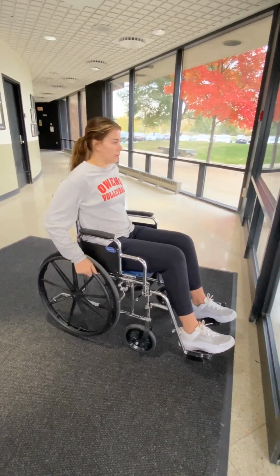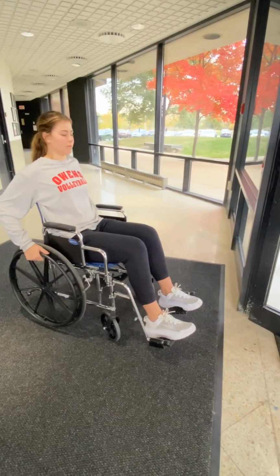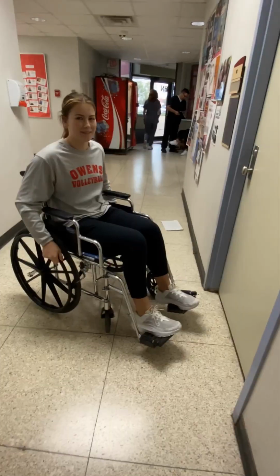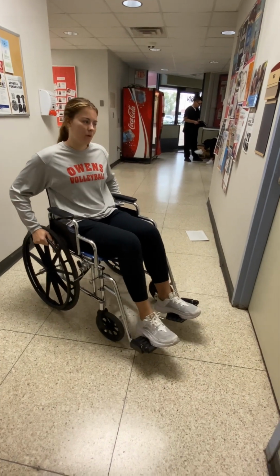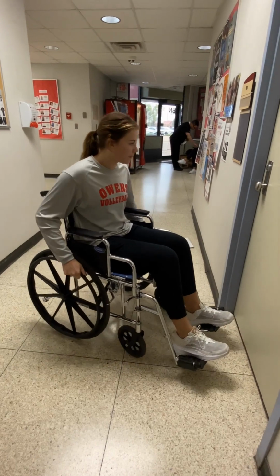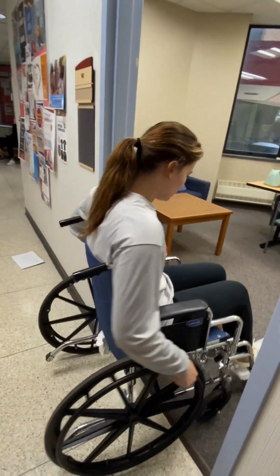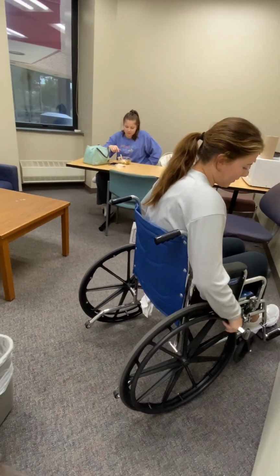So you roll up to the door, press the button, wait for the door to open, and then roll through. Go. Okay, so now we're going to do independent forward with the door opening away from the patient. So you go up to the door, open it, turn around.